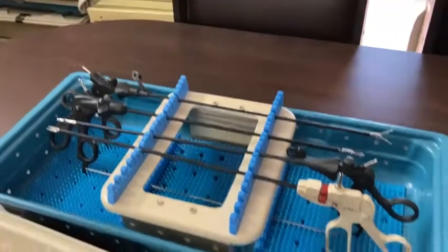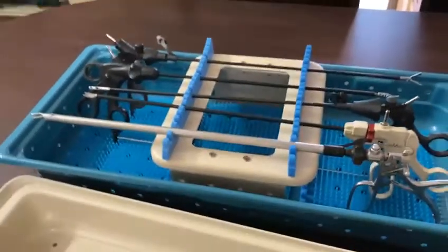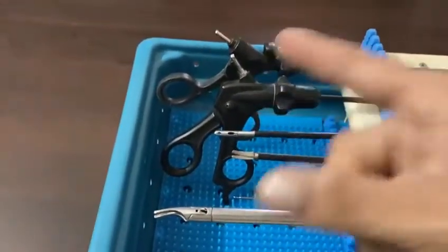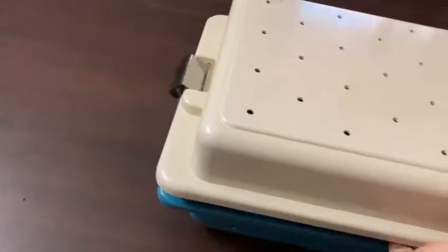You can keep up to 14 to 20 instruments with this. And it's very easy to identify the tip of the instrument with this. Thank you very much.